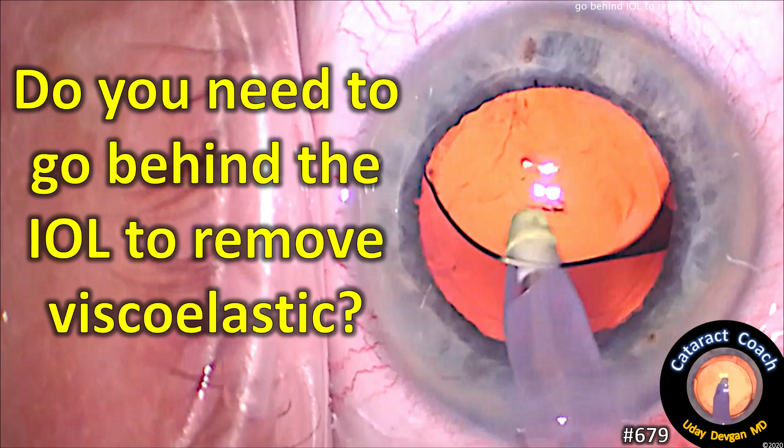CataractCoach.com. Do you need to go behind the IOL to remove the viscoelastic? It seems like a difficult maneuver.